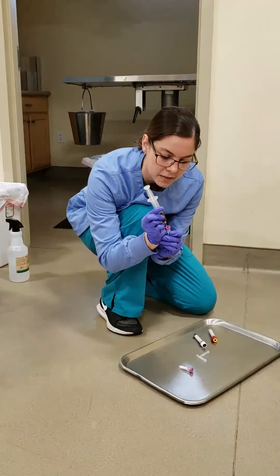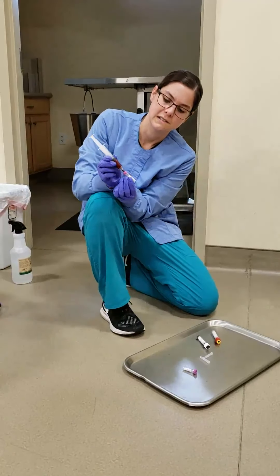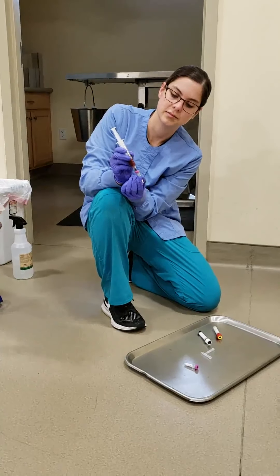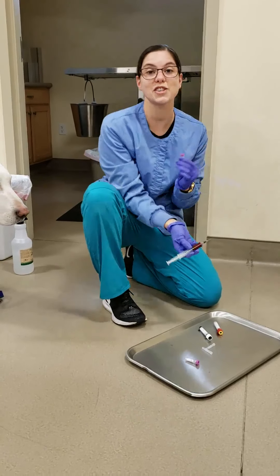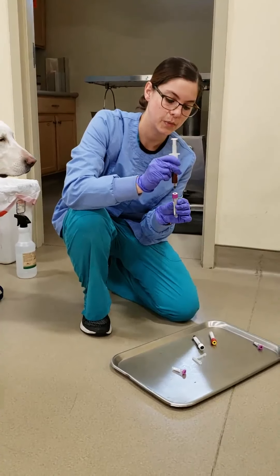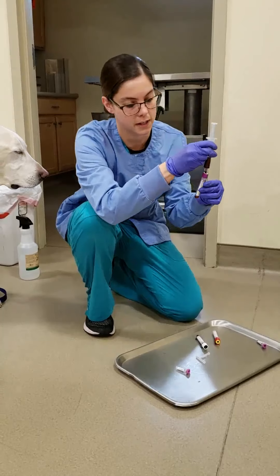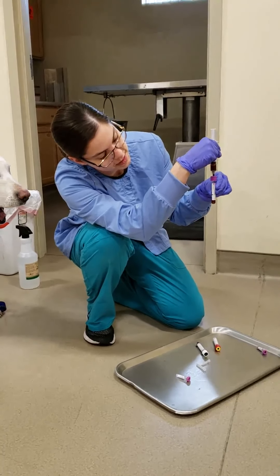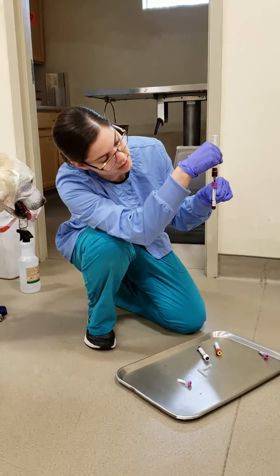The vacutainer is already working. Since that little one didn't work, we'll use our big vacutainer. And again, we want to get it to at least 90% to that fill line.